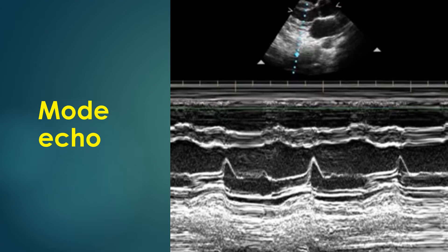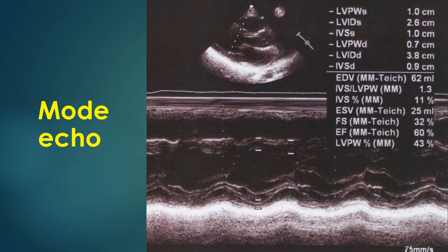The vertical axis in this image is depth and the horizontal axis is time. Important measurements taken are: LVPWS (left ventricular posterior wall systolic), LVIDS (left ventricular internal dimension systolic), LVPWD (left ventricular posterior wall diastolic), IVSD (interventricular septum diastolic), EDV (end diastolic volume), and ESV (end systolic volume).